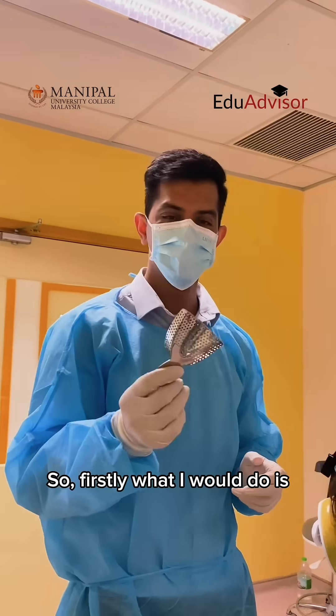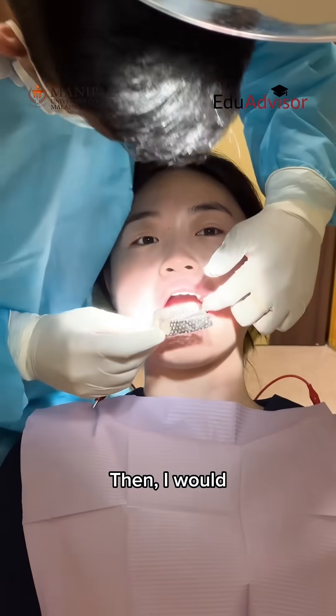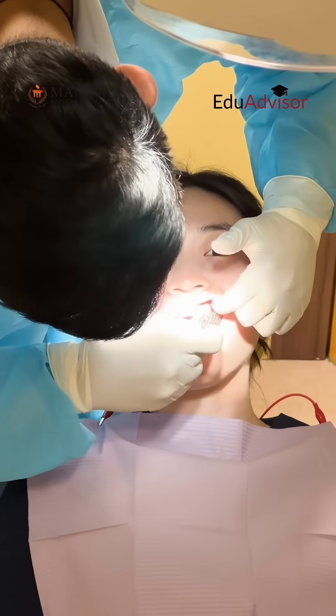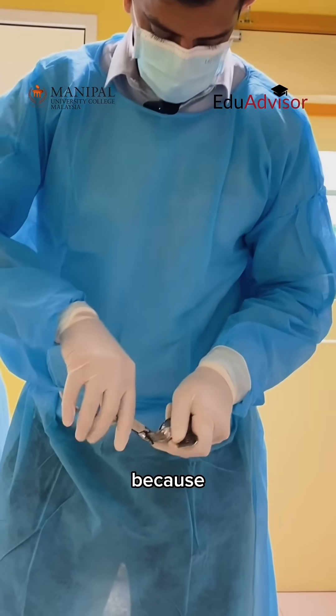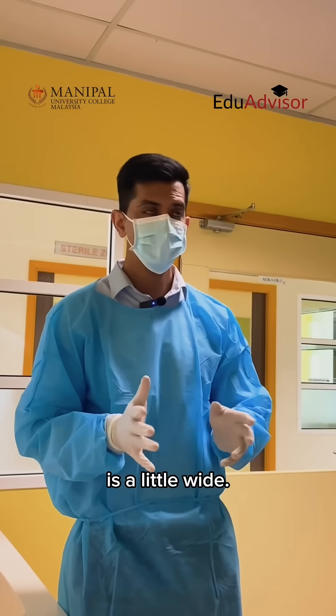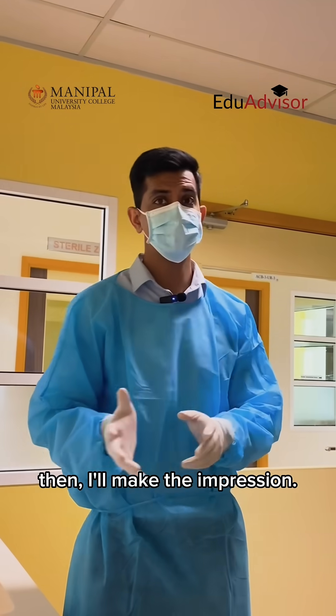So firstly what I would do is I would select a tray, then I would check it in the patient's mouth. I just need the plier to open up the tray because her arch is a little wide. Once it's all fine then I'll make the impression.